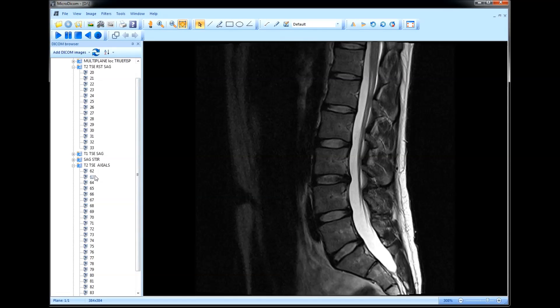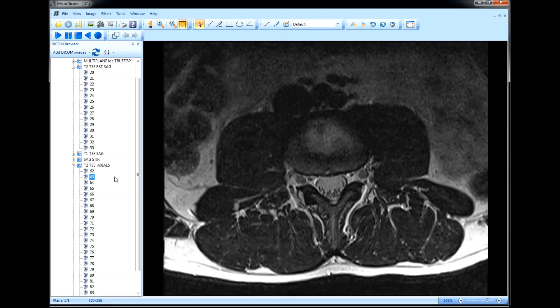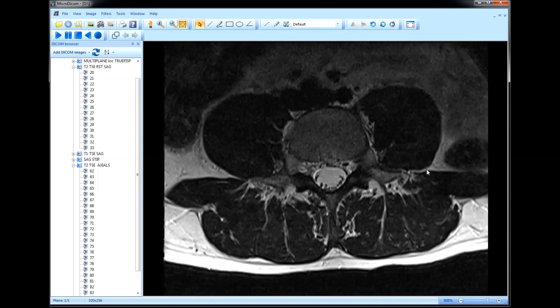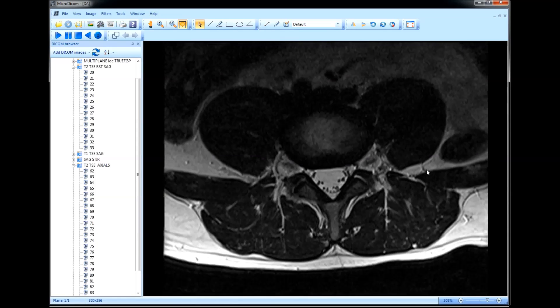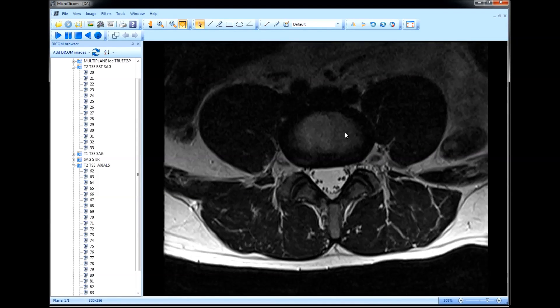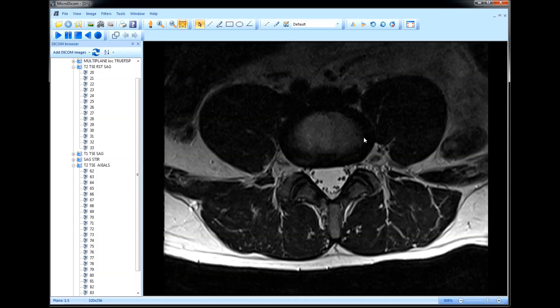Looking at the axial view — which is the transverse section of our spine images — you can see that in the center is the nucleus, the soft shock-absorbing material, and on the outside you have the ring, which is the annulus.